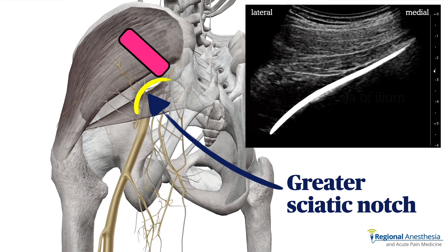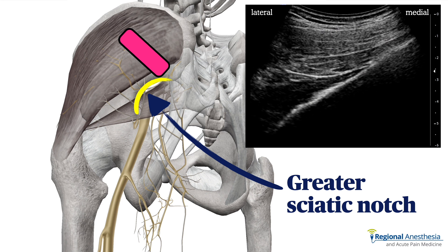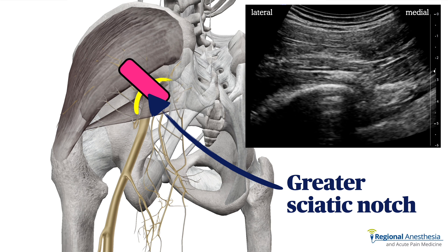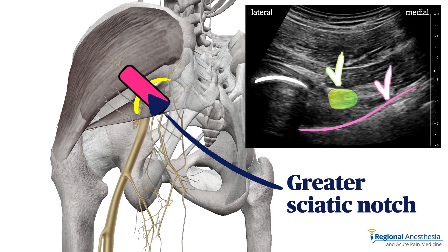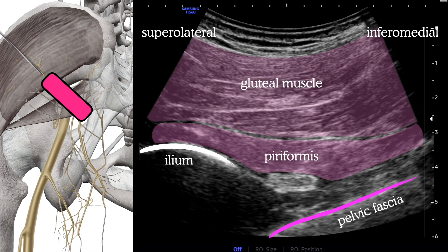First, we'll place the probe at a 45-degree angle further cephalad so that we can visualize the continuous line of the ala and the overlying gluteal muscles. We then slide directly south until we find a breach in that continuous line. This represents the sciatic notch, and we can see both the sciatic nerve and the pelvic viscera deep to the notch. With the probe positioned over the sciatic notch, we see the convex portion of ilium and the pelvic fascia inferior and medial to that. Superficially, we see two muscles — the glutes and the piriformis muscle, which directly overlies the notch at this level. Immediately deep to the piriformis is the sciatic nerve. A 10-centimeter block needle will be advanced from lateral to medial.